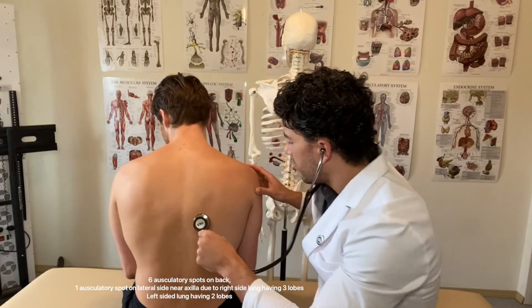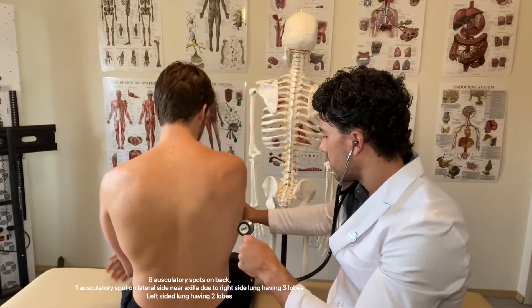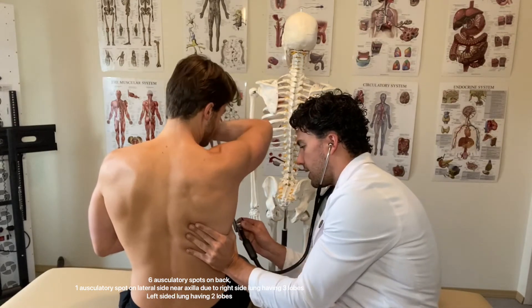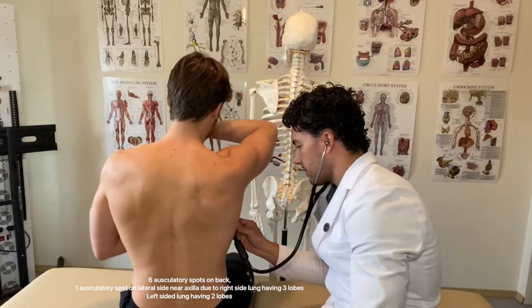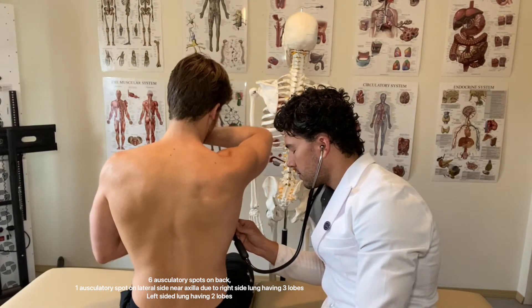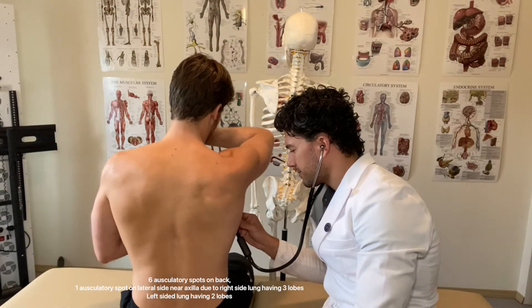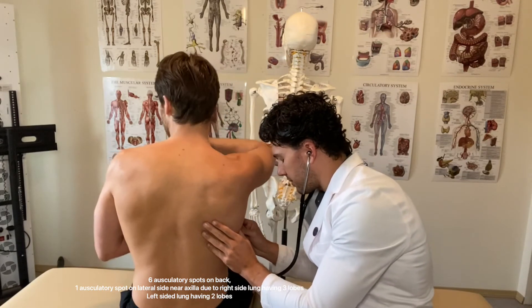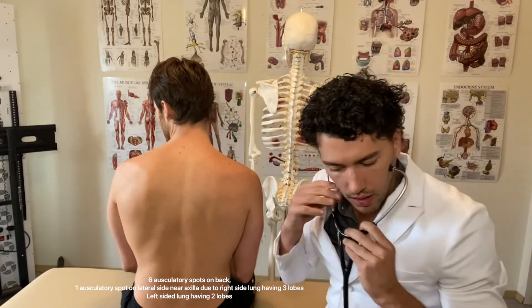Can you move your right side over a little bit and displace the breast tissue away? I'm going to move the lat a little bit out of the way, just right about there. Breath in. Okay — all sounded normal.